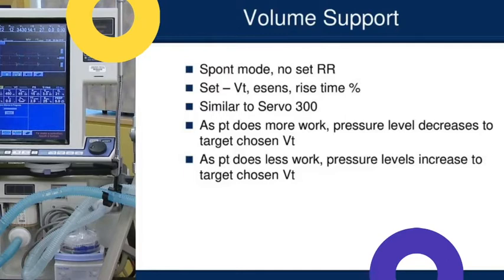Volume support, spontaneous mode, not set RR, set tidal volume, sensitivity, rise time. Similar to Servo 300. As patient does more work, pressure levels decrease to target chosen tidal volume. As patient does less work, pressure levels increase to target chosen tidal volume.